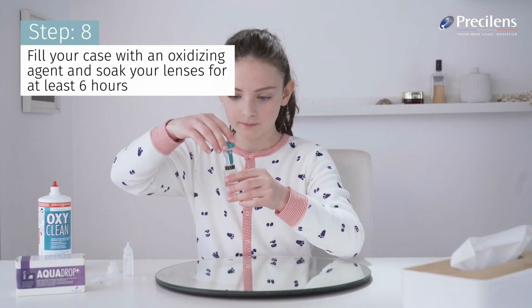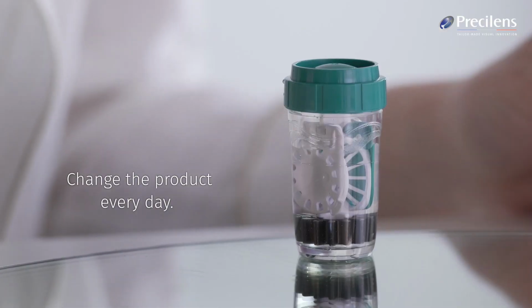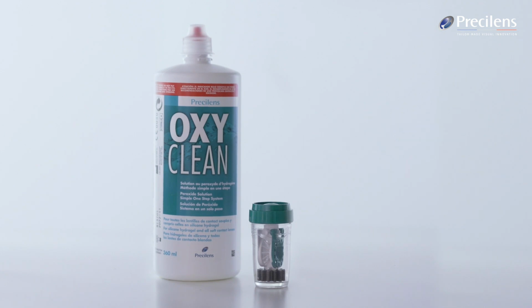Fill your case with an oxidizing agent and soak your lenses for at least 6 hours. Change the product every day. As soon as you change your oxidizing agent bottle, remember to change your case.